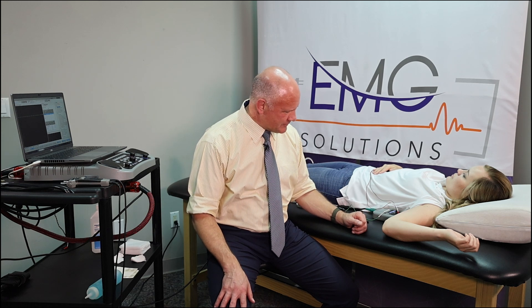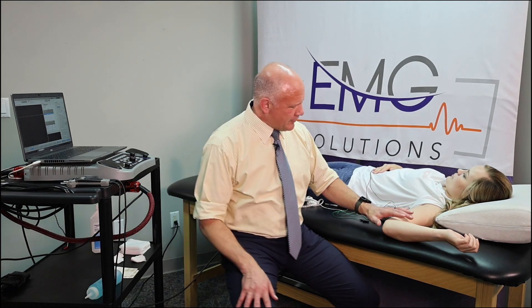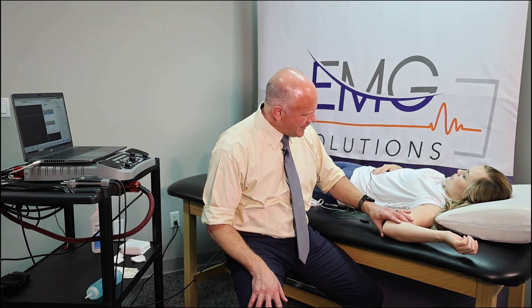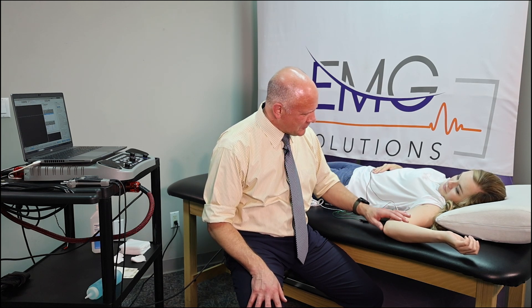In today's video we will be focusing on the testing procedure for a nerve conduction study of the ulnar nerve. My name is Quinn Millington, I'm the owner and founder of EMG Solutions. You'll notice that we've got our patient laying on the table with her arm abducted almost at 90 degrees but it's pretty close.